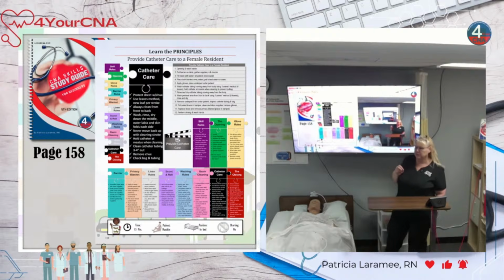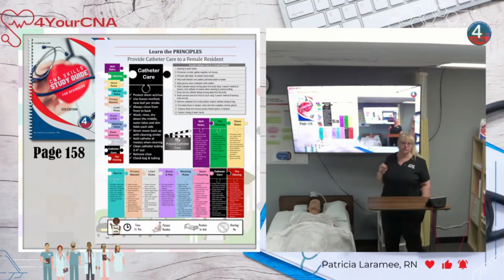Do you guys remember PeriCare? This is PeriCare with an extra step. They gave us 17 minutes for PeriCare. They're giving us 15 minutes to do catheter care. So I need you to understand that almost every skill that I talk about, I say you got plenty of time.